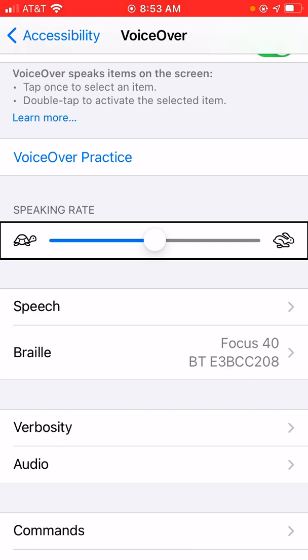In order to customize gestures for individual Braille displays, you're going to want to go to VoiceOver settings, which I have open now, and then find the Commands button at the bottom. So, I'm going to go ahead and flick to the Commands button.